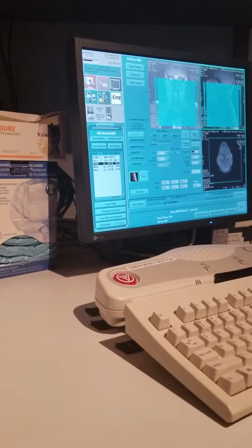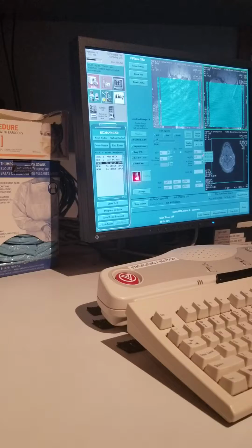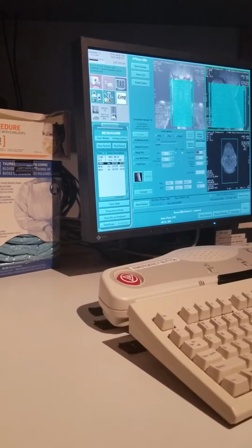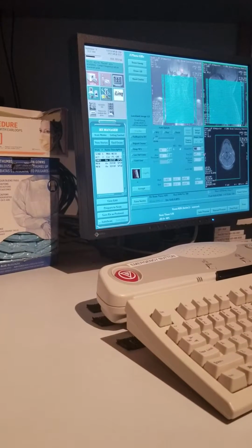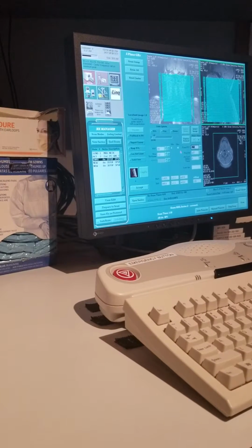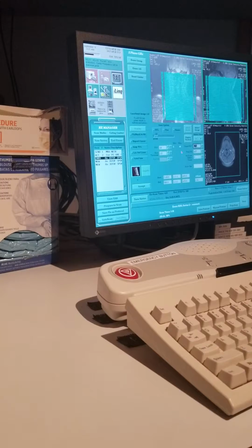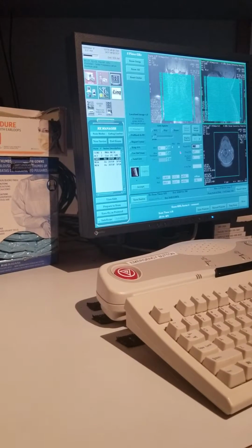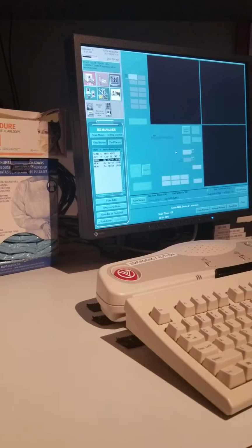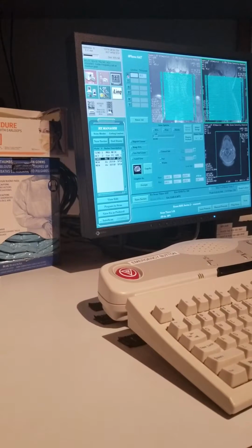That's the key. And where's our SAT? We forgot our SAT. Now we know the SAT is there because it's programmed, and according to Bill, he believes it's there already, even though we don't see it. But we show the students to place it there because we want them to visually see it, because in the real world, we're seeing the SATs and we're bringing them. So let's make sure we place the SAT superior, so the venous flow spins are nullified, so we don't see the venous flow.